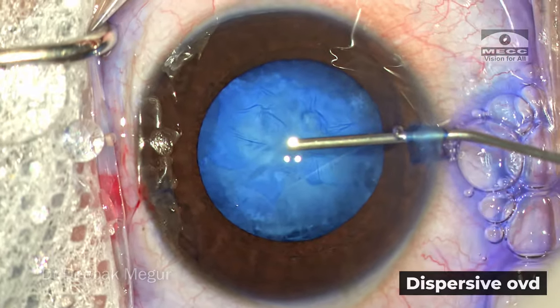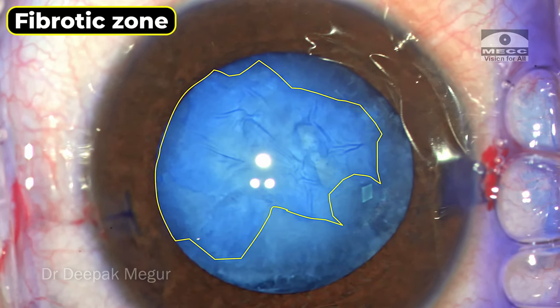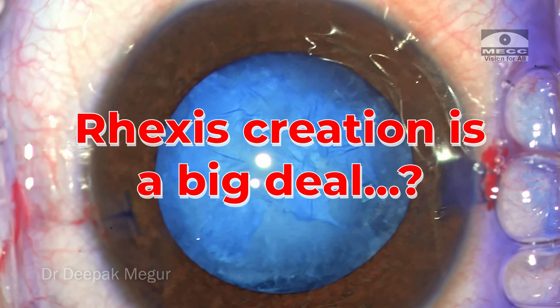Now it is evident — the zone of the anterior capsule where there is extensive fibrosis. In most pediatric cataracts, the most challenging aspect is the rhexis itself. The rest of the surgery is extremely easy. In this case, because of the long-standing nature and the fibrotic capsule, the rhexis itself is the most challenging step.